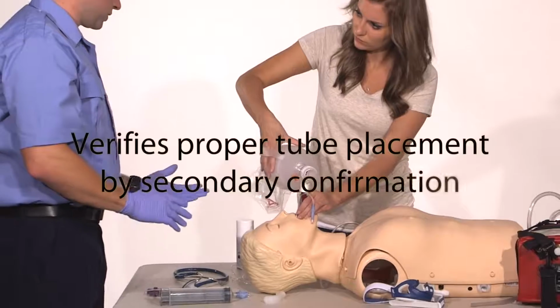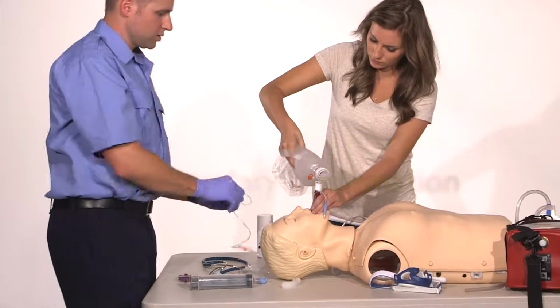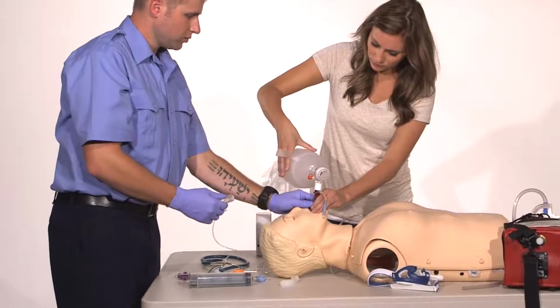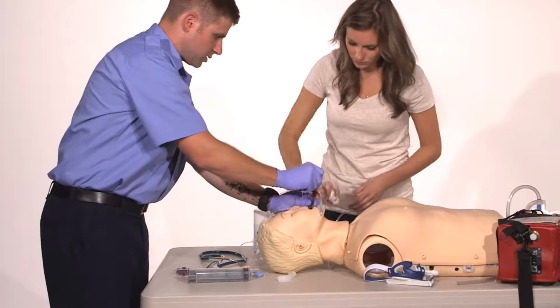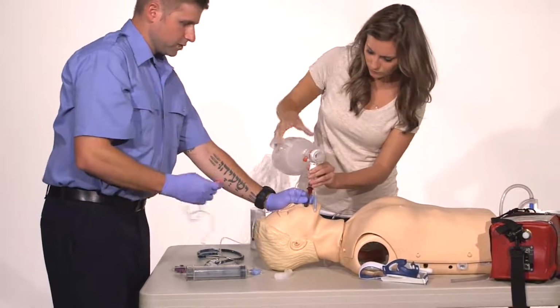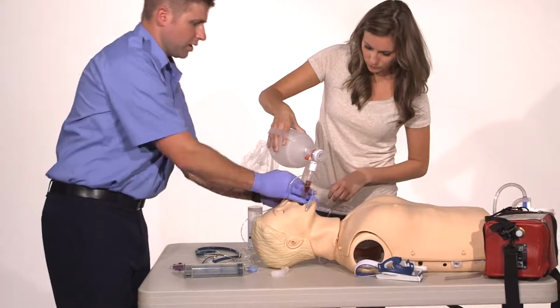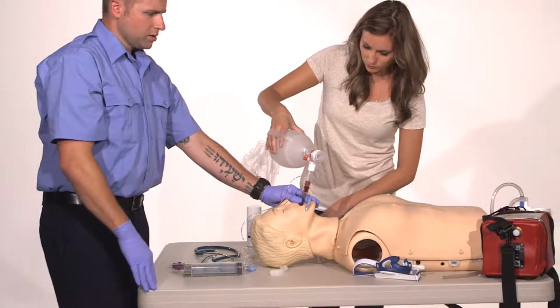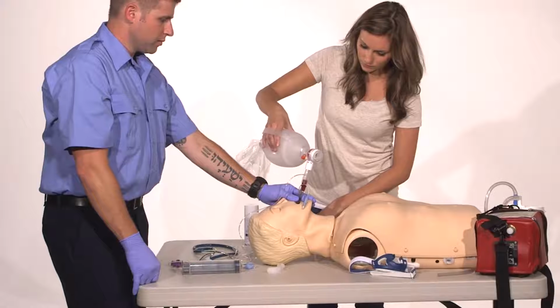At this time, I would use a secondary confirmation, so I can use my end-tidal CO2. I'll secure the device. Can you remove the bag? I'll place the end-tidal and place the bag back on. Continue giving ventilations. I would connect this to my monitor, and I should see a proper capnography waveform on the monitor.